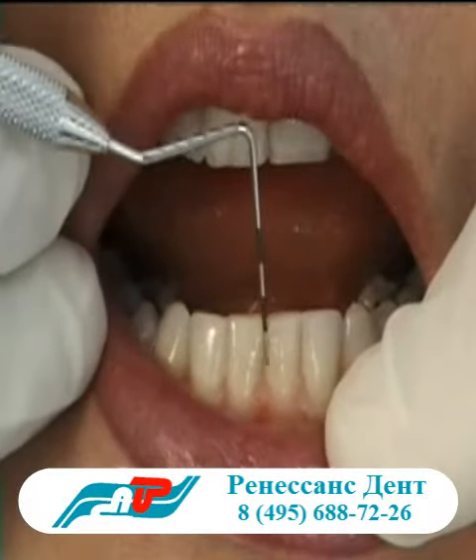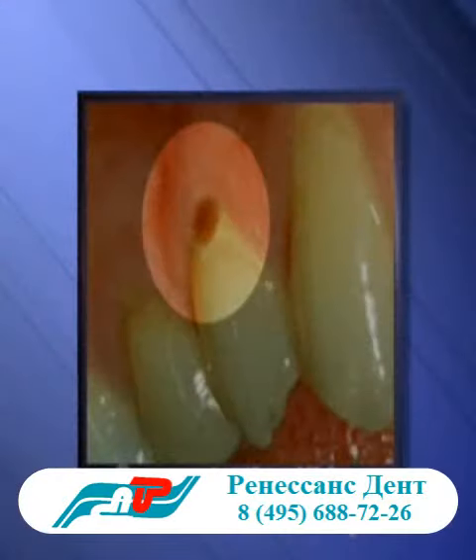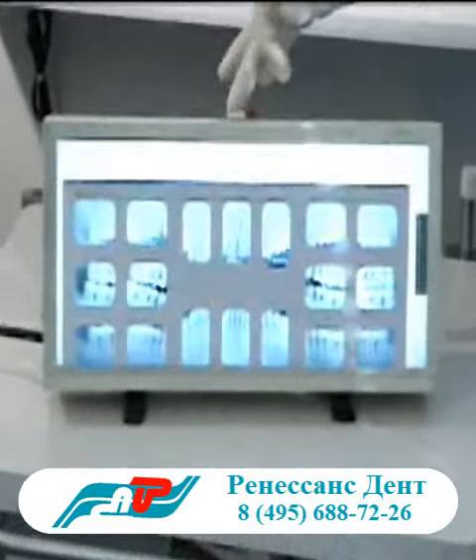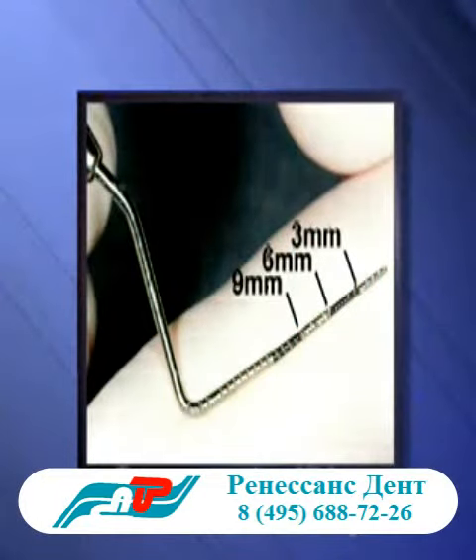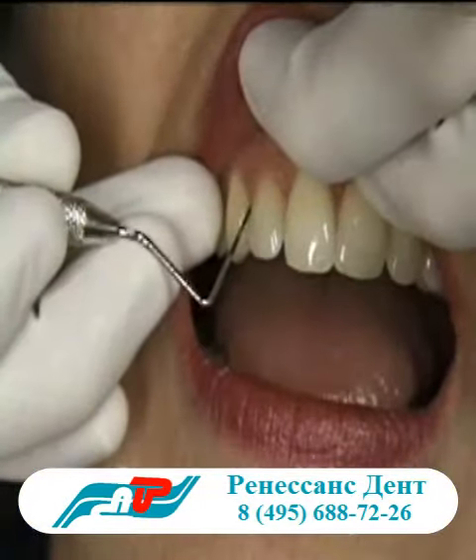The diagnosis of periodontal disease and cavities are two important parts of a dental examination. Since you may have periodontal disease yet have none of the symptoms, we perform a thorough examination using X-rays and a periodontal probe to measure bone levels around the teeth.